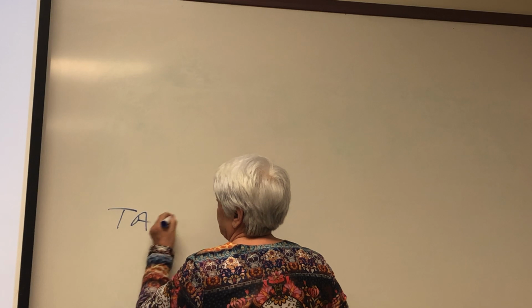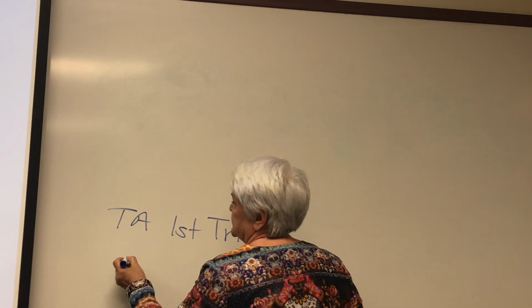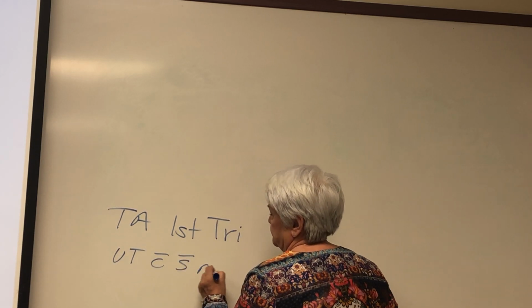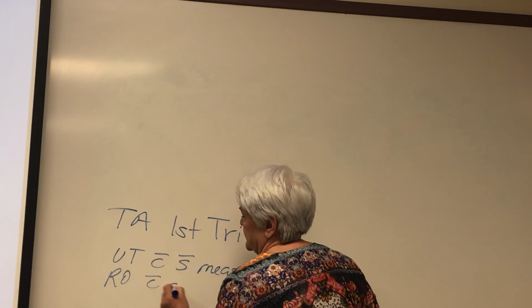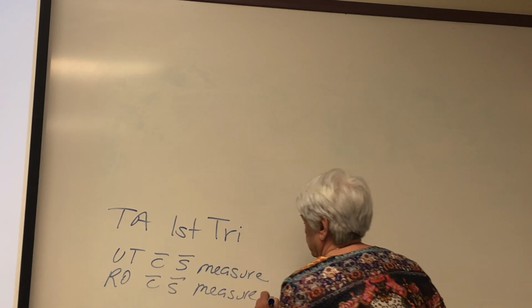Transabdominal, first trimester. I'm going to do uterus with and without measures. I'm going to do right ovary with, without measure and color.